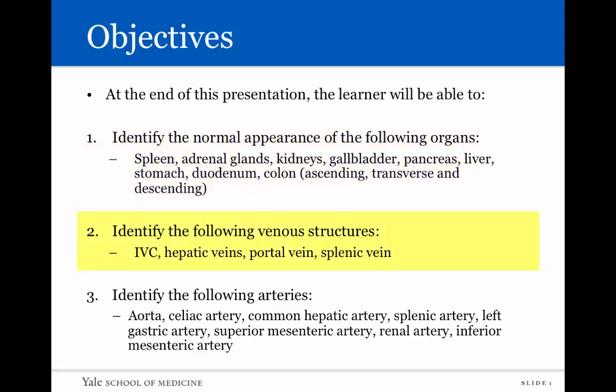You'll also be able to identify the following venous structures: the inferior vena cava or IVC, hepatic veins, portal vein, and splenic vein. And finally, you'll be able to identify the following arteries: the aorta, the celiac artery, common hepatic artery, splenic artery, left gastric artery, the superior mesenteric artery, the renal artery, and the inferior mesenteric artery.